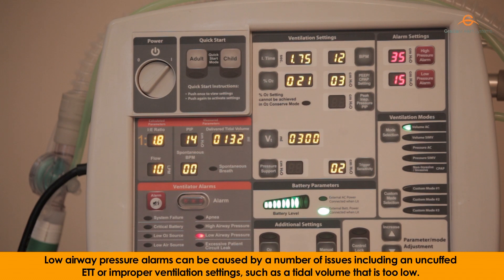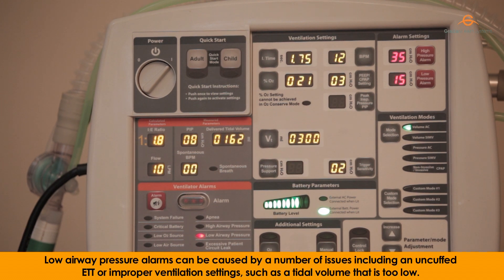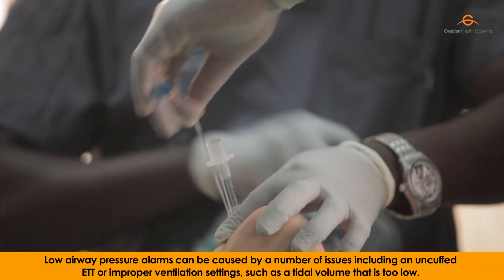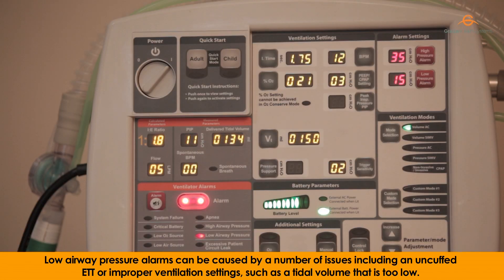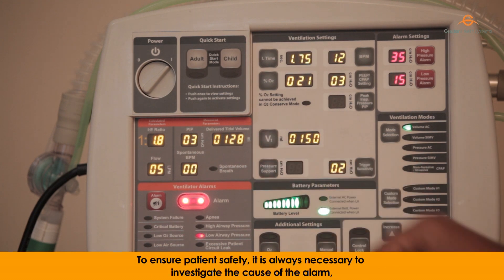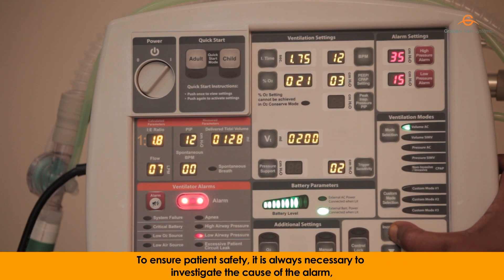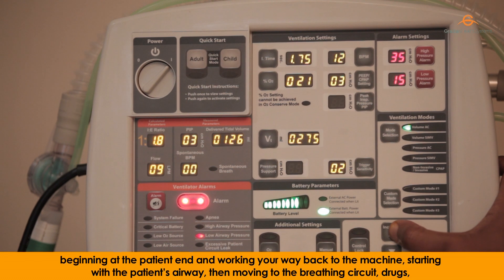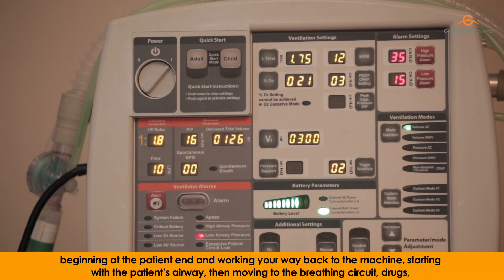Low airway pressure alarms can be caused by a number of issues including an uncuffed ETT or improper ventilation settings such as a tidal volume that is too low. To ensure patient safety, it is always necessary to investigate the cause of the alarm, beginning at the patient end and working your way back to the machine.